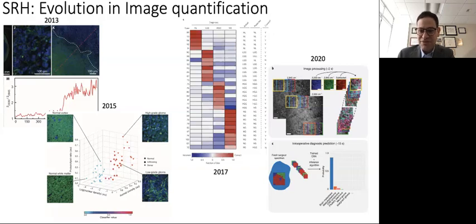This figure shows the very basic quantification of the CH2 to CH3 ratio in the bonds that we're imaging as we move across the field of view from normal brain to tumor. As we imaged more and more, we realized that morphologic information could also be useful in detecting the presence of tumor. And a number of brilliant University of Michigan med students working in my lab developed increasingly sophisticated ways of using cellular and axonal quantification techniques to combine with biochemical information to train a classifier to differentiate tumor from normal brain in this 2015 paper.